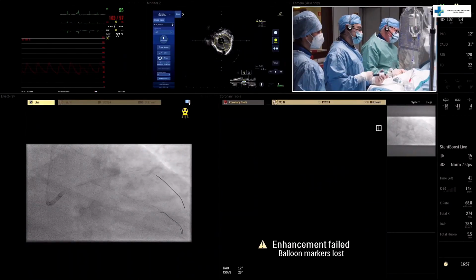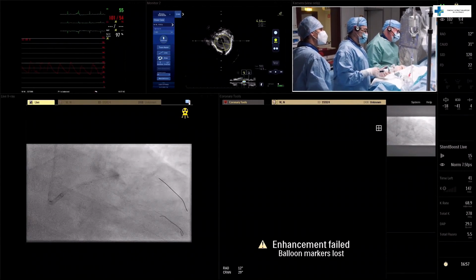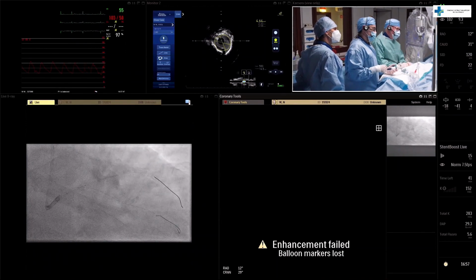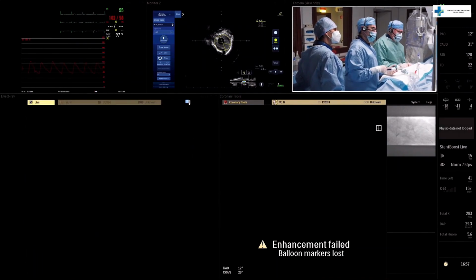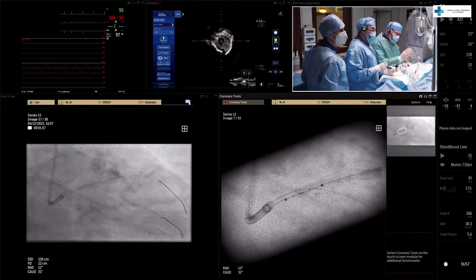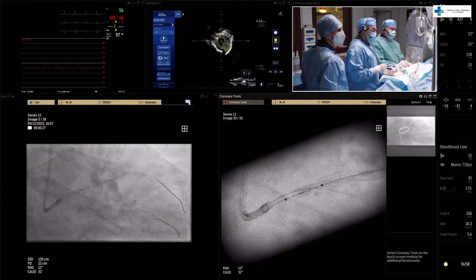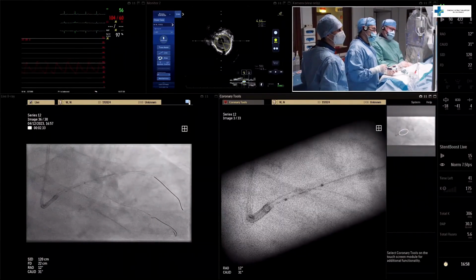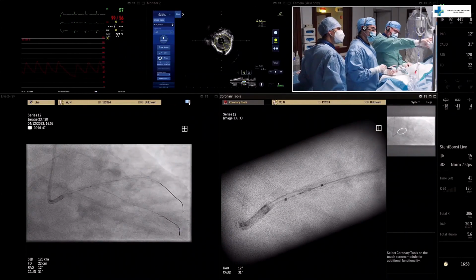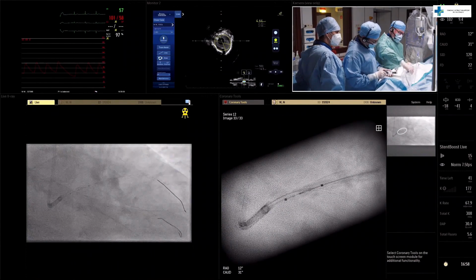So we have our 4.0, 12 millimeter long IVL catheter, and I will try to position it just with overlap, which we check with stent boost. Then we are really sure that we are in the left main, Pavel. We are touching the stent with the marker. We know that the proximal edge of the stent is in the left main, and we see that we cover all the calcium which is in the distal part of left main. So please inflate 4 atmospheres.